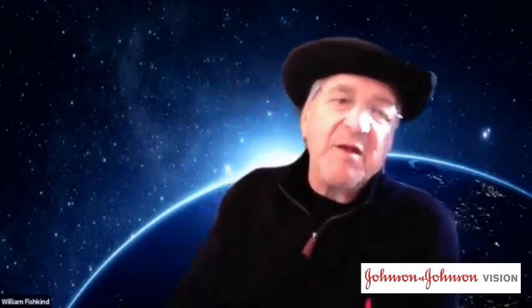The next thing to recognize is not all of those opportunities are good opportunities. And so when we find ourselves stuck in positions where scaffolding isn't going to work, then we need to make the next step to glued IOLs, or Yamani techniques. That's the next part of this spectrum. Thank you very much, Bill.